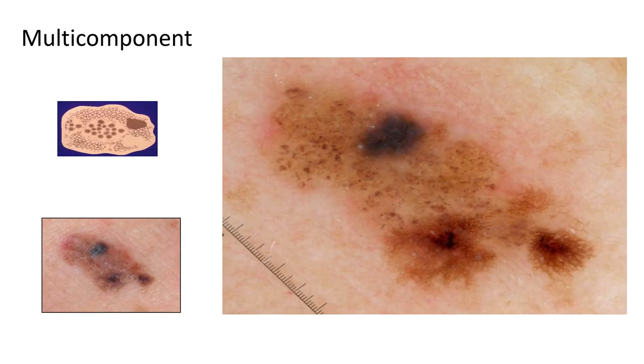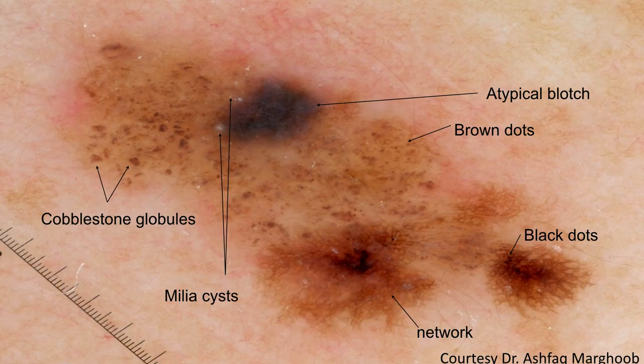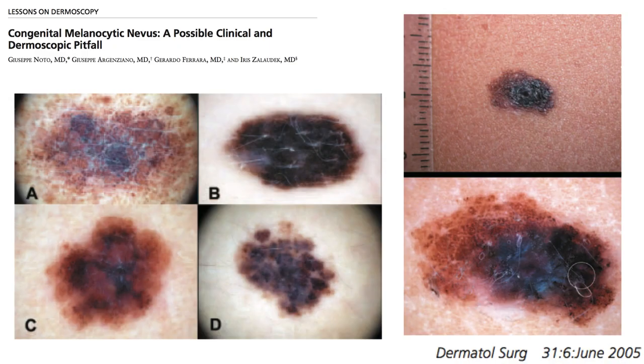The final pattern is the multi-component pattern. This is when we see many different dermoscopic structures, and clinically and dermoscopically it often raises the differential diagnosis for melanoma. We see cobblestone globules, black dots, brown dots, atypical blotch, milia-like cysts, and network — many different structures. Without knowing this was present at birth and had a long-standing history of stability, this would be a lesion coming off to rule out melanoma.